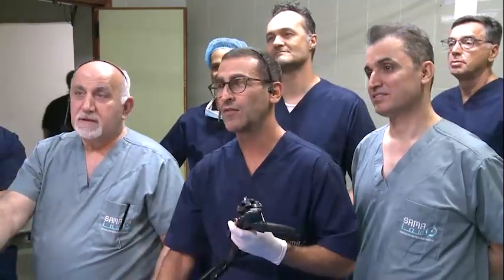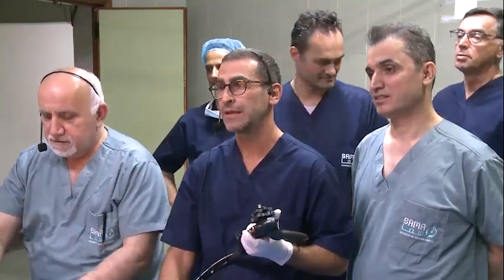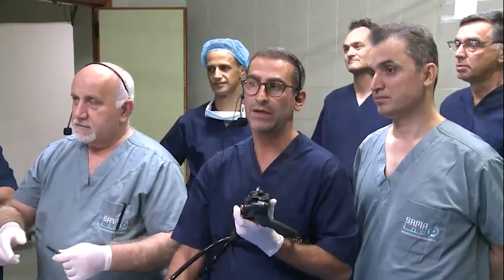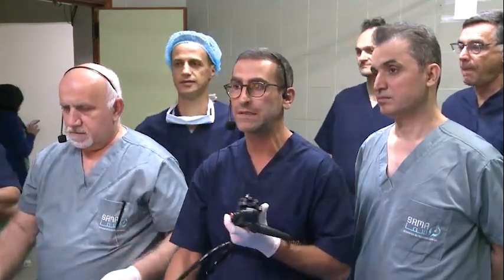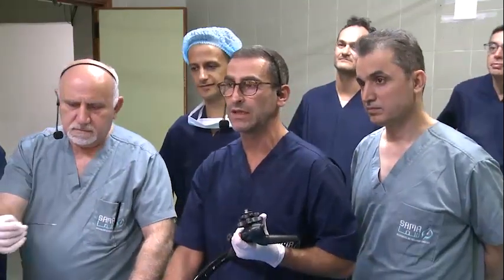Then, of course, it was grasper. I will take the grasper because. What was unexpected in this case, that's why in endoscopy you always have to be careful and patient. Sometimes you think it's an easy case, but not so easy, as you can see.